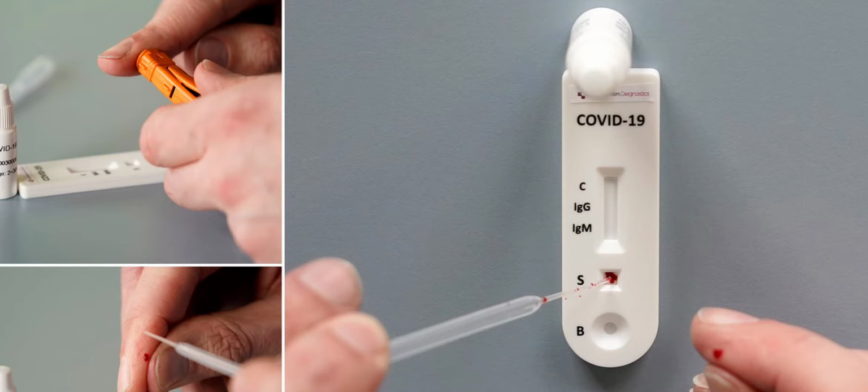And C is the end point, that is the control. If you reach the control point, we can say your sample has been completely analyzed. After it reaches the C point, you have to see whether you have indications on the IgM and IgG lines. If IgM or IgG is present, it will show a line on the test kit.